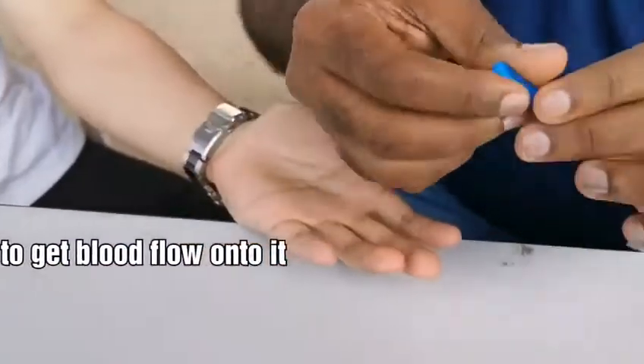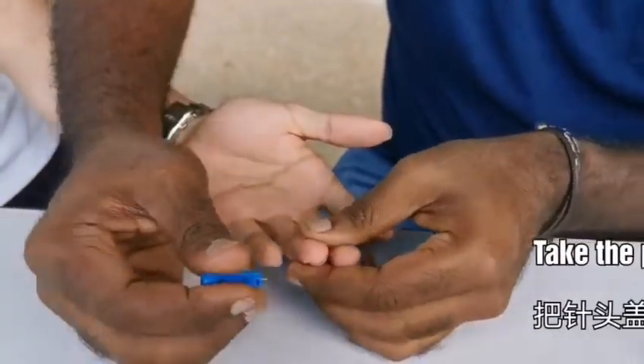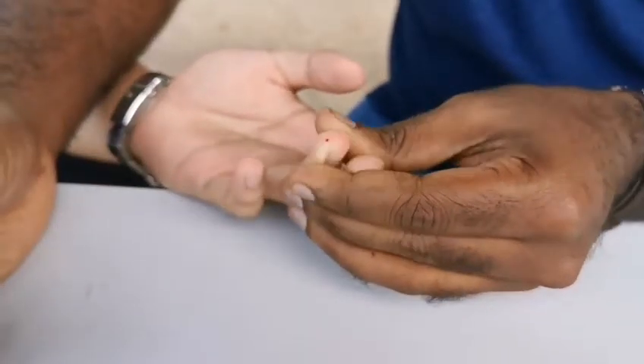Then you take the prick — it is actually a small needle — and you just prick it. You can see blood coming out.